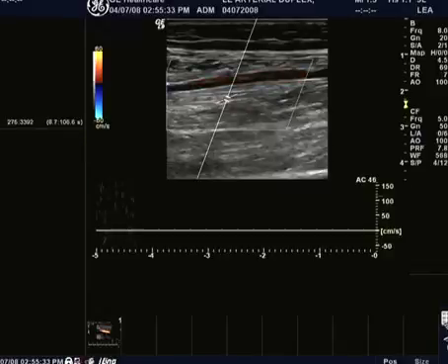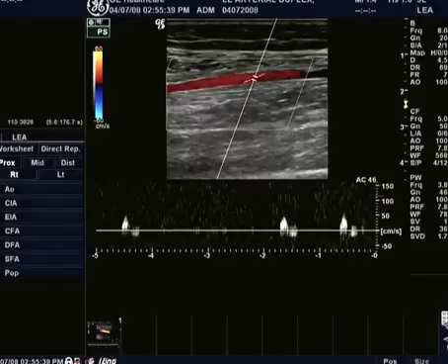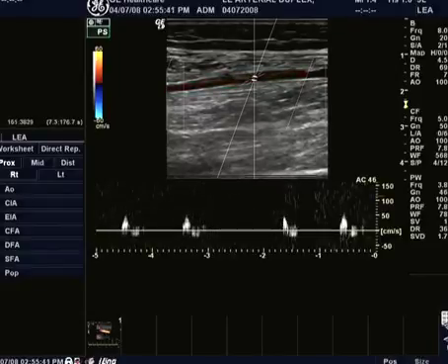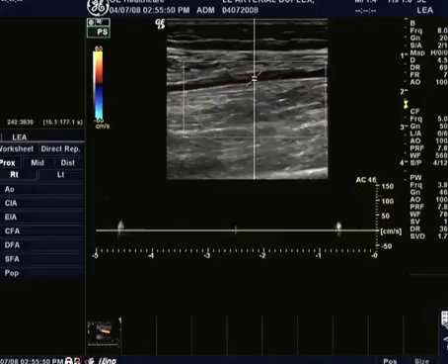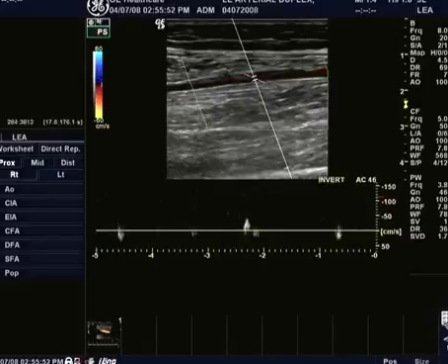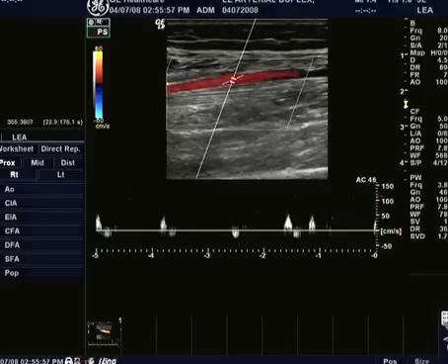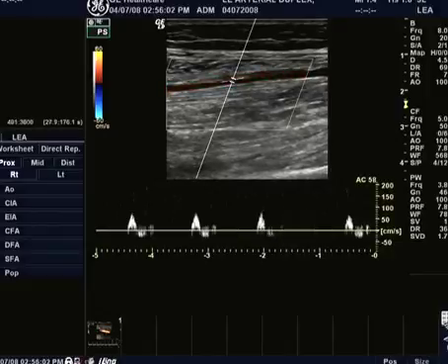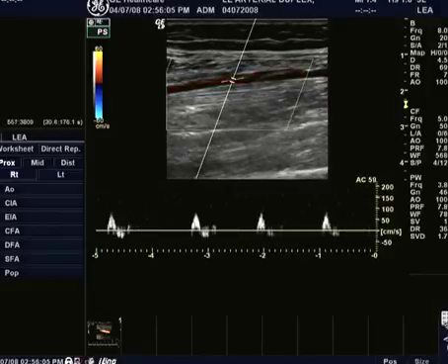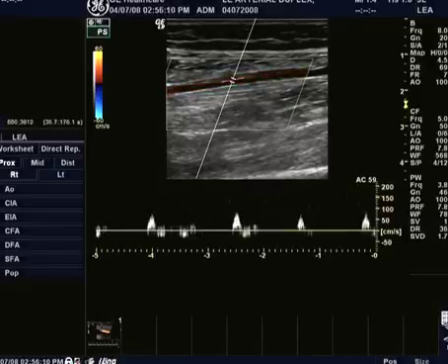And lastly, we'll put in our spectral Doppler. Now we had turned the gain up a bit because we were deep for the popliteal. And I guess that would probably be the best approach. Sorry. We're going to adjust the cursor. Again, 60 is great. We definitely don't go over 60. And we're at 59, which I think is pretty decent.